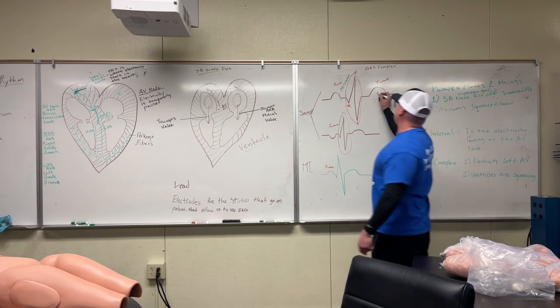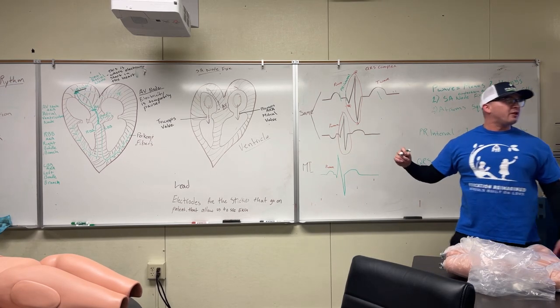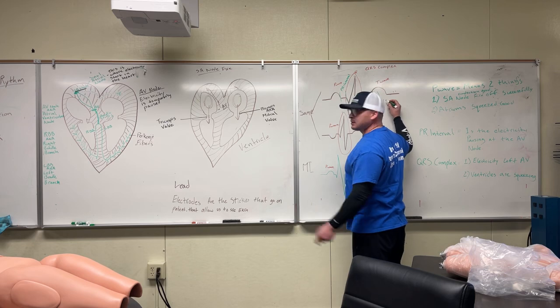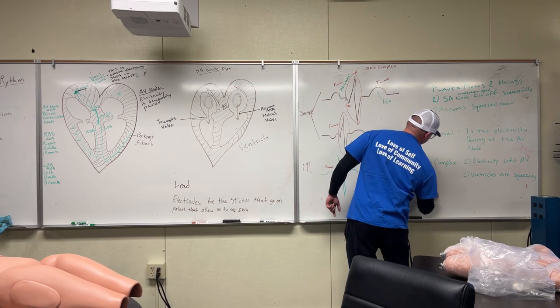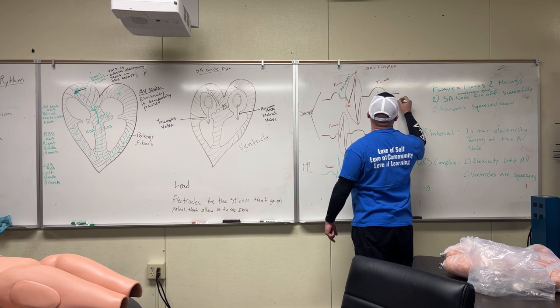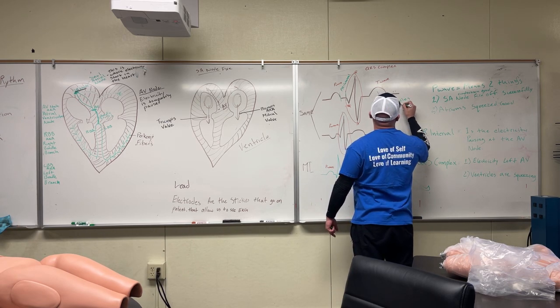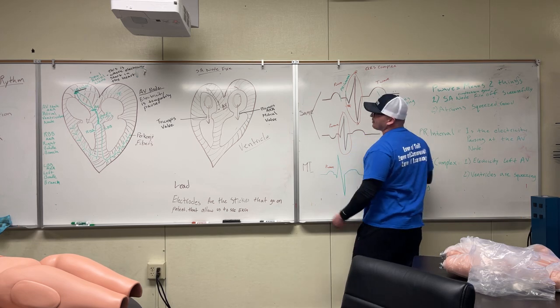And then the last note, I'm just gonna do it here. The T wave means that ventricles are relaxed. So this will be your last note. That would be under here. Okay, it would have been, but we don't have time for that. Relax. Okay. That's all we get.